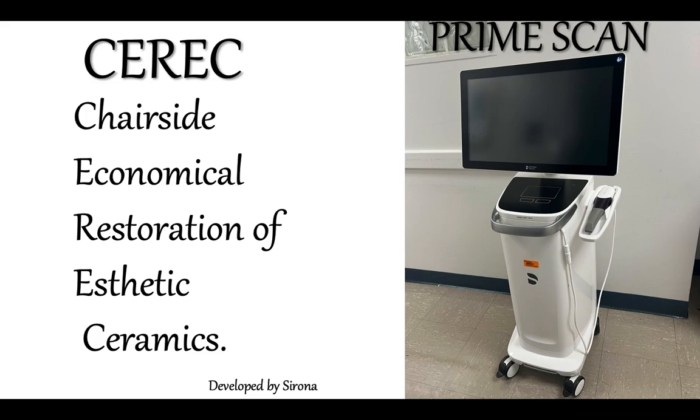Well, as you can see here on the screen, you have the Prime Scan. This is a touch screen. It is very easy to use. It is the first one used, and therefore it is known as a closed system. Why is it closed? Because it does not let you import STL files or any type of file from another software to design in this one.